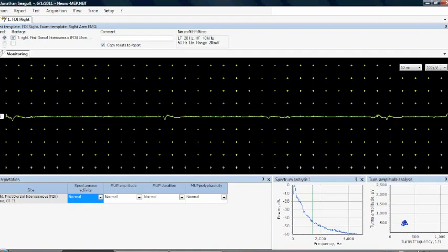Anything above that is going to have a high amplitude and polyphasic potentials. Anything in this low end of the square is going to be maybe polyphasic but low amplitude. So if things are above, they're going to be called neurogenic. If things are below, they're going to be called myopathic, generally speaking.